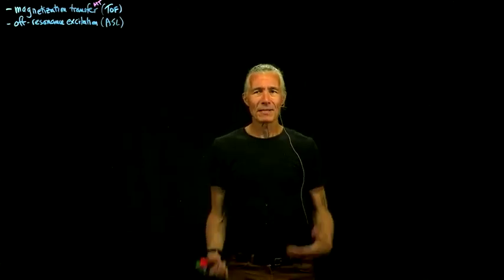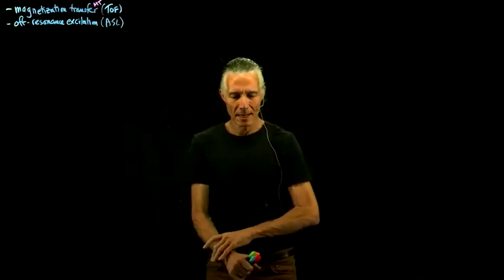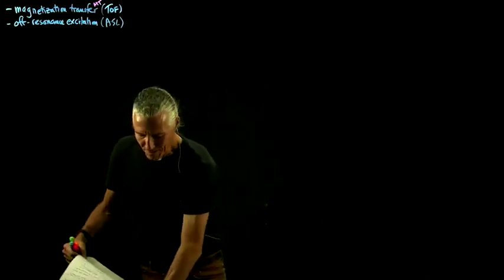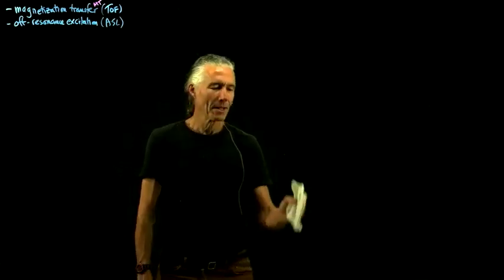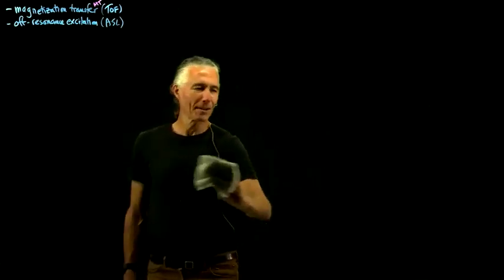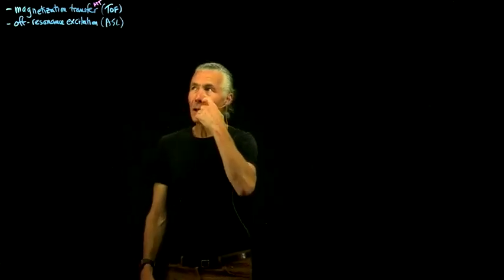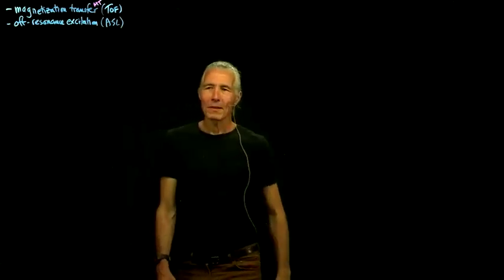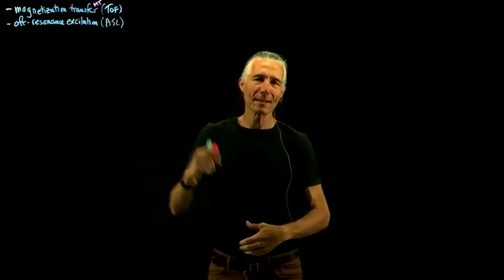Like an X-ray, you basically got an X-ray. You do the X-ray, you can't really change the contrast, but MRI is incredibly flexible. You can get T1 contrast, as we've all learned about in the homework, or T2 contrast, or proton density contrast, or perfusion contrast. We'll talk a little bit about that when we talk about time of flight.